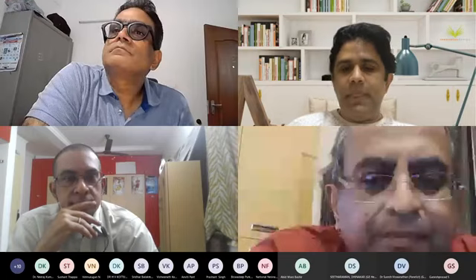Dr. Suresh. Yeah, thank you. Two things. One is most companies will give you a demo which will allow you to hold on to the monitor for several days, so that you can actually develop a personal comfort. So before buying or deciding on any monitor, please ask for a demo that you can use with your patients. If you're starting a new hospital, in the initial procurement, you don't have admissions yet. It might not be feasible, but do try to test out all the monitors and see what you're comfortable with.